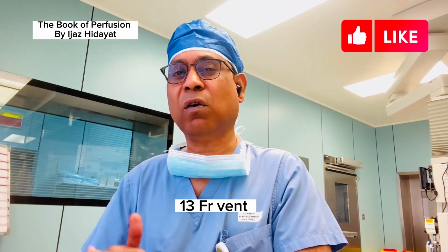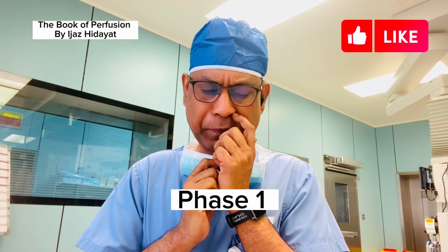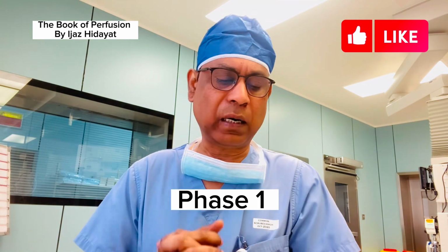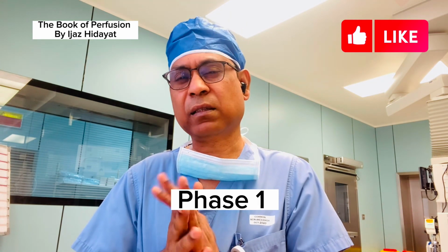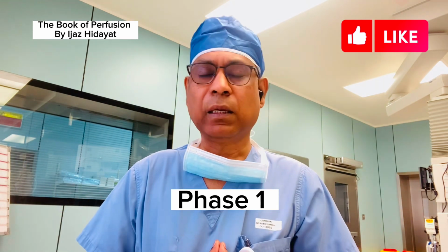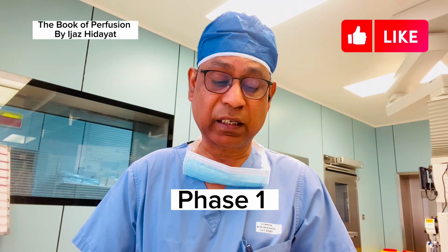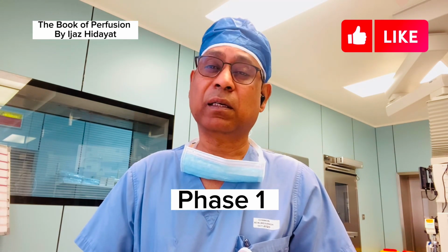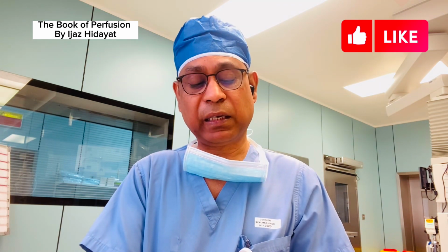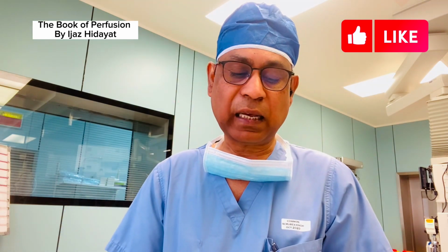There are phases of the cardiopulmonary bypass. Let's talk about phase 1. In phase 1, we always keep our dry heart lung machine and cell saver ready inside the OR. We keep the venous and arterial cannulas and connectors on standby in the operating room. We keep the ACT machines and blood gas machines available in the operating room prior to starting the surgery, and we always keep the assembled ECMO circuit in the OR once the decision is made and we are planning to do the lung transplant surgery. This is phase 1.